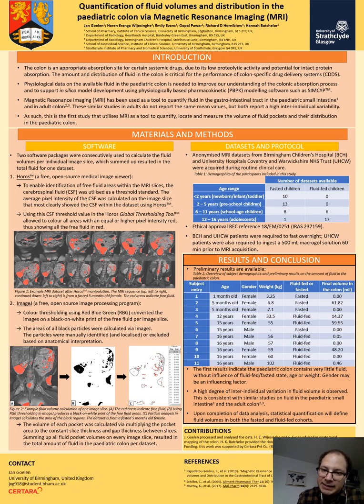In figure 1, we see a nice example dataset of the thresholding in HOROS. The red zones here are areas where the pixel intensity was equal to or higher than the threshold value based on CSF, meaning the red areas indicate free fluid. Now, fluid with pixel intensity just below the threshold has not been picked up. That's not bad because we're only really interested in free-flowing fluid within the colon, not in fluid that's located in mucus. That's also why we compare to the intensity of the CSF as a standard for free fluid.